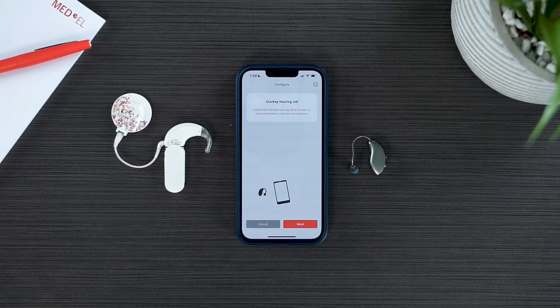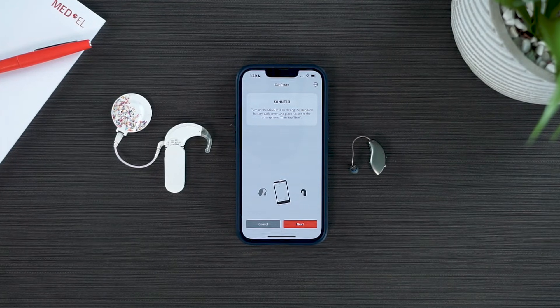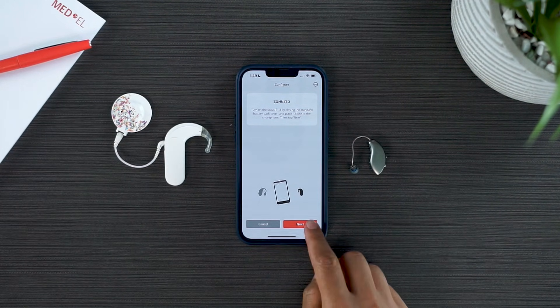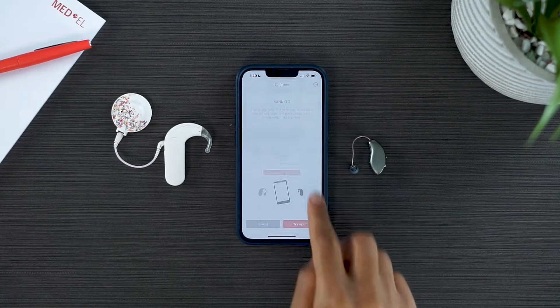When the hearing aid symbol appears, make sure your hearing aid is close to your device and select Next. When the processor symbol appears, turn on your Sonnet 3 and select Next. If your processor doesn't connect at first, simply wait a few seconds and select Try Again. Once the Success window pops up, select OK.